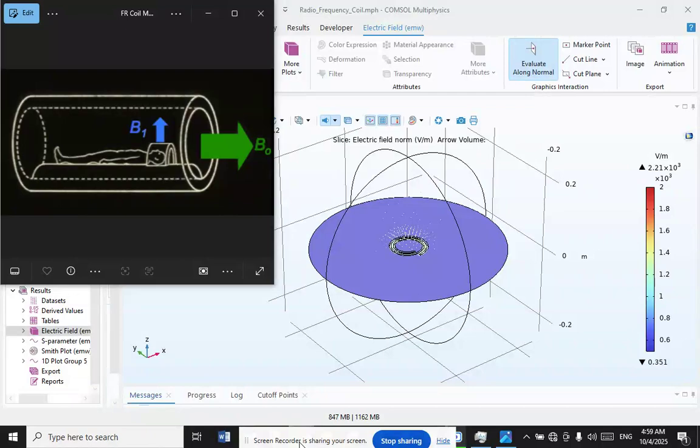Actually, radio frequency coils or RF coils are the receivers and sometimes also the transmitters of radio frequency RF signals in equipment used in magnetic resonance imaging or MRI. The MR signal in MRI is produced by the process of resonance, which is the result of radio frequency pulses. They consist of two electromagnetic coils, the transmitter and receiver, which generate the field and receive the resulting signal.